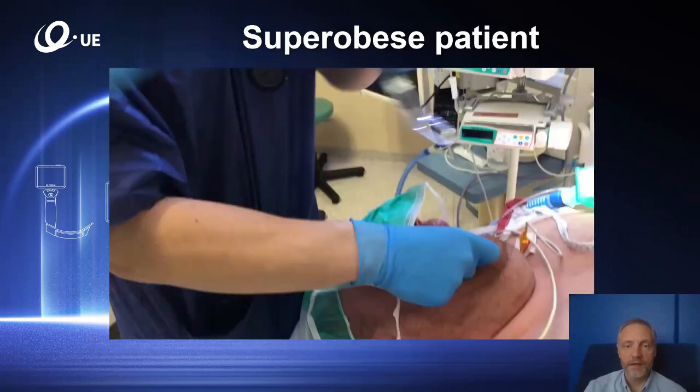Super obese patients are met when the BMI is over 50 kilograms per square meter. And this patient was 180 centimeters tall and weighed 180 kilograms. As you can see on this movie, the insertion again was quite easy because of the diameter of the blade.